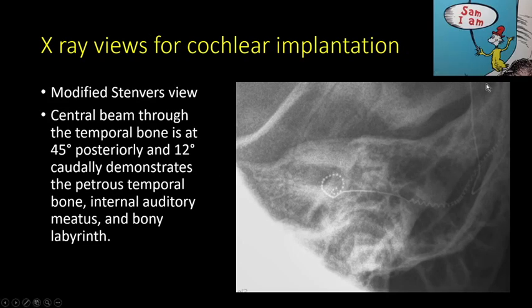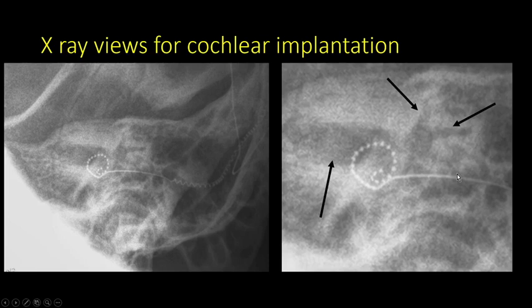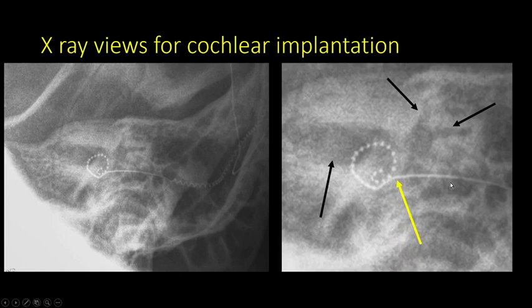The view most commonly used for post-implant x-rays is the modified Stenvers view — an oblique view at 45 degrees posteriorly and 12 degrees caudally — which shows the petrous bone, IAC, and bony labyrinth in better detail. This allows visualization of the entire cochlear electrode, the internal auditory canal, and the superior and lateral semicircular canals. The electrode can be seen entering and coiling more than 270 degrees within the cochlea, and the cochleostomy site is identifiable.